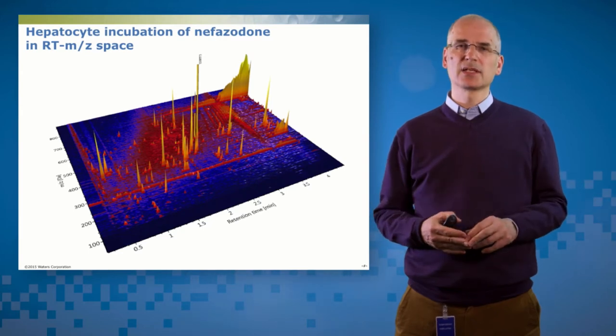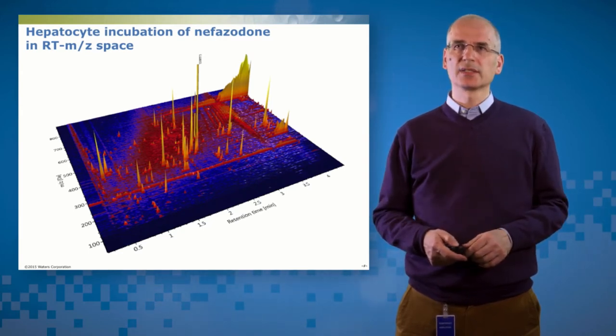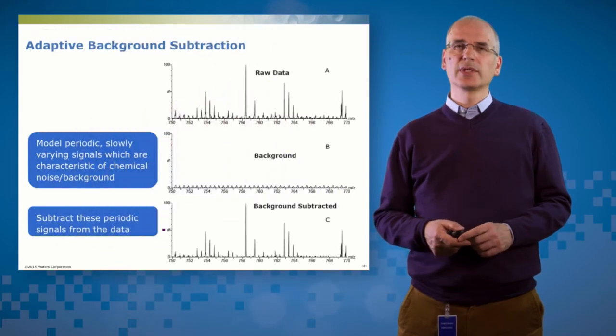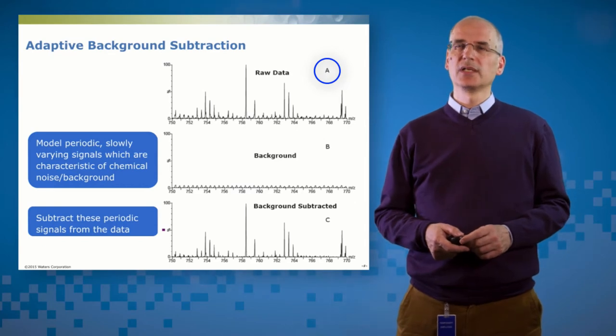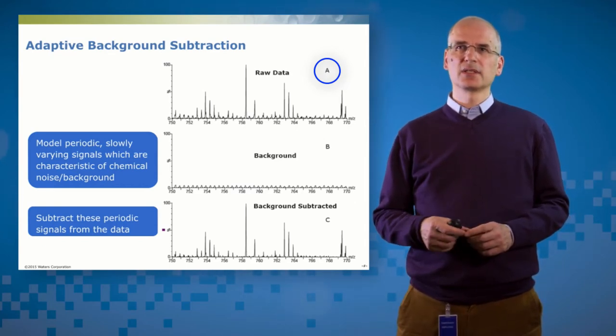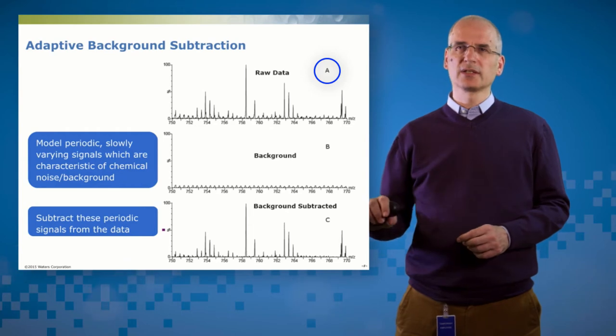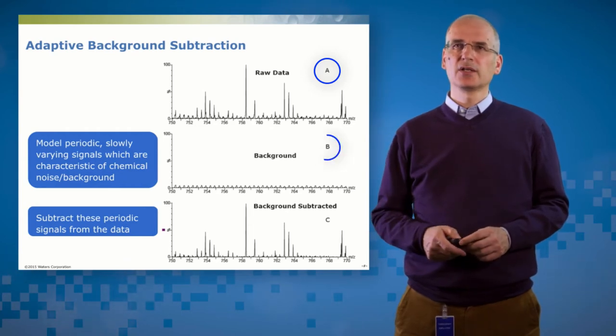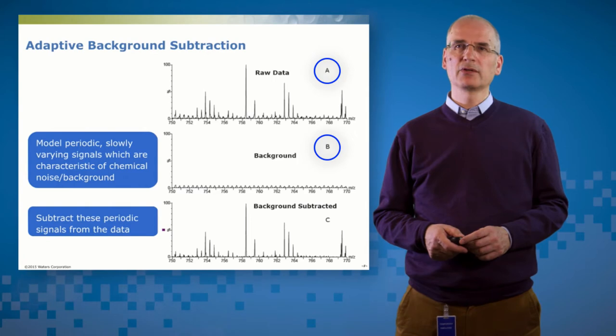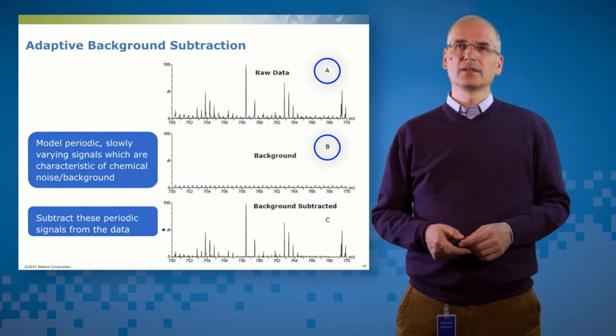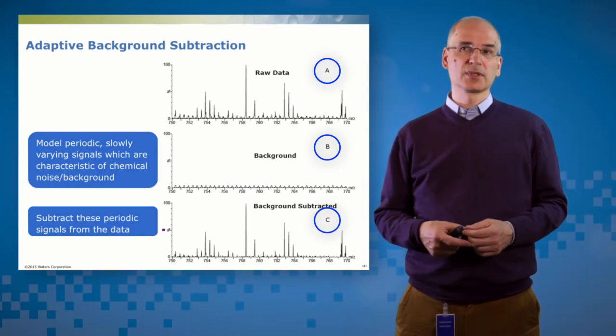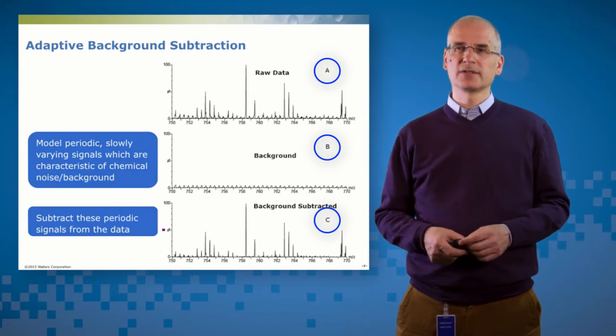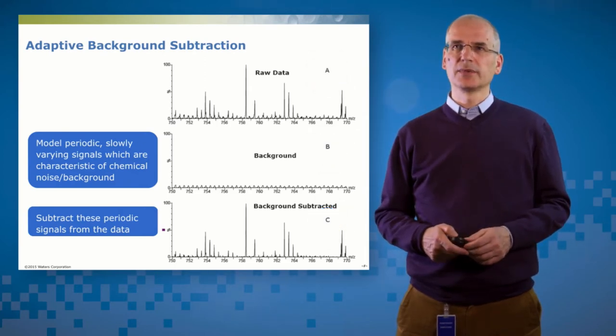So how can we address that challenge of noise? We want to maximize the signal that we have but we want to reduce the noise which is present. So one thing that we can do is called adaptive background subtraction. So on the top in panel A you can see a raw spectrum and inside that raw spectrum there are some consistently varying low-level signals which are very periodic and those are characteristic of the chemical noise in the background and we can create a mathematical model for those. Then we can subtract those periodic signals from the data to give you panel C. So that's the background subtracted spectrum and of course that's got a lower amount of noise in it.